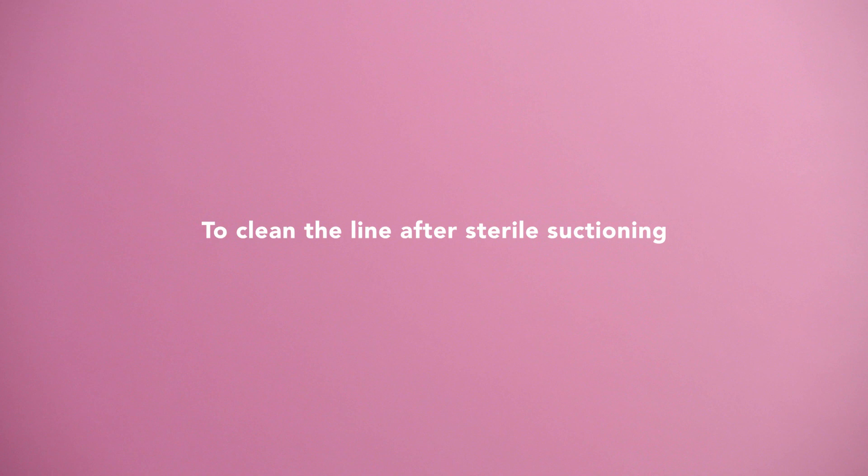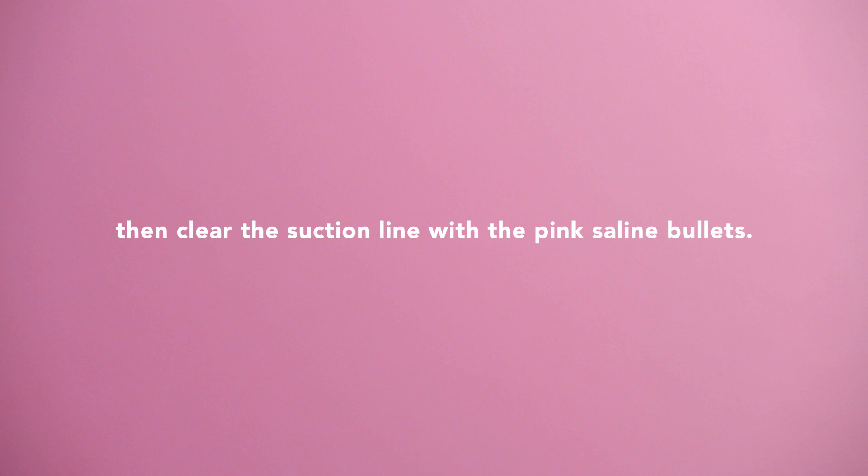To clean the line after sterile suctioning, remove the catheter and throw it away. Then clear the suction line with the pink saline bullets. Turn off the suction.